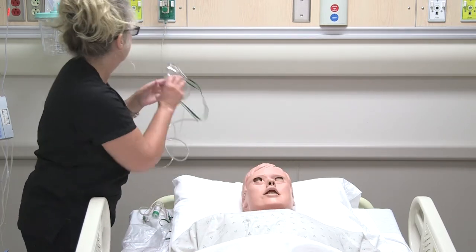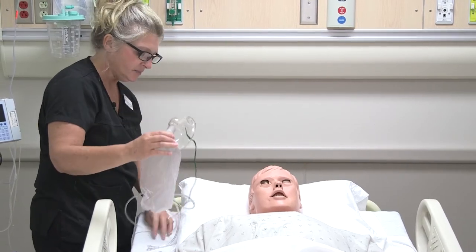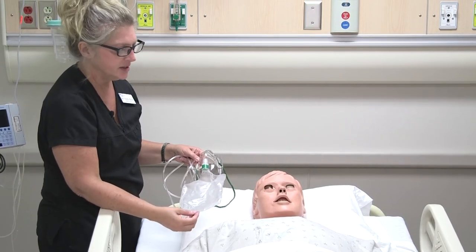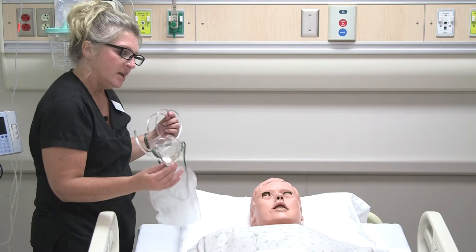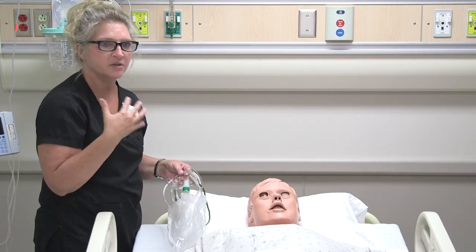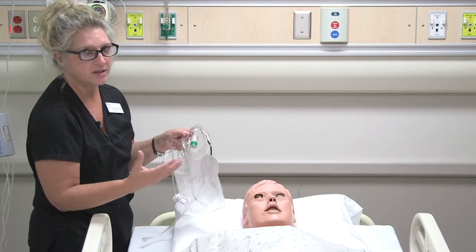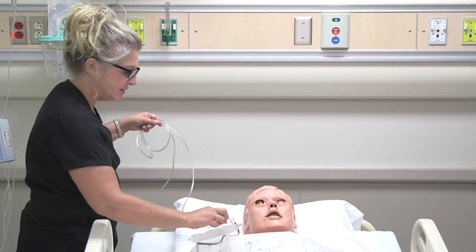We can remove this one and then we'll go into what we call a non-rebreather. This one you may see as the patient's respiratory status declines. It's usually not used routinely unless the patient is having very low oxygenation — you see this a lot if patients may be to the point where they might have to go on BiPAP. With a non-rebreather, the patient is not breathing in their carbon dioxide. The carbon dioxide goes out and it doesn't go back into the mask — it stays away from going back in. We also fill this reservoir bag up with oxygen, so it should be about two-thirds full at all times, so that the patient has oxygen available at all times and they're not rebreathing their carbon dioxide or mixing it with the oxygen.